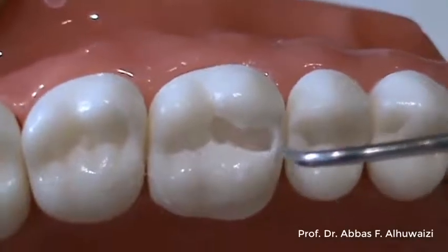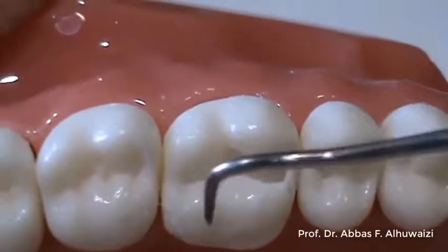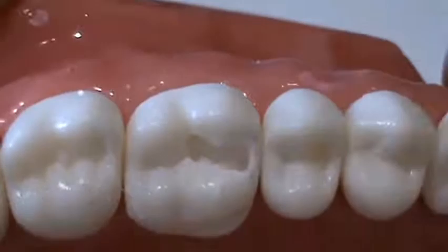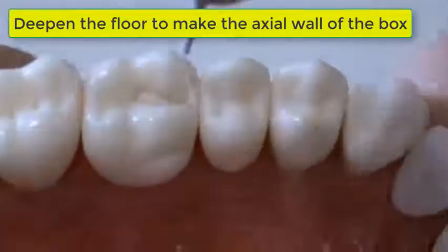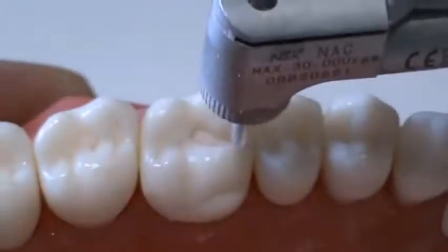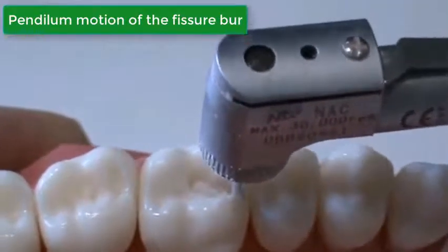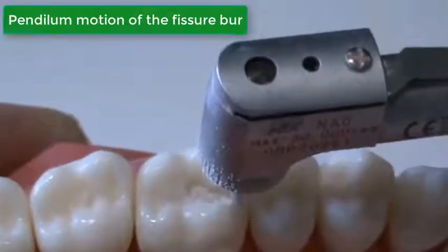The depth of the cavity should remain the same as with the Class 1 cavity. Step 2. Making the depth of the box. Place the fissure burr at the mesial marginal ridge and push the handpiece downwards to create the axial wall.